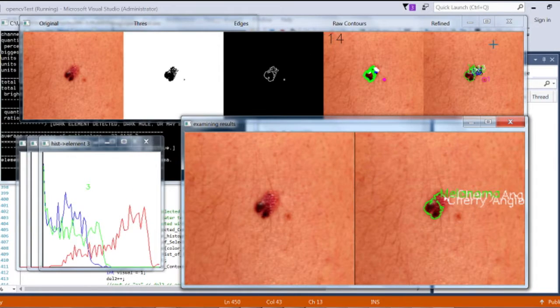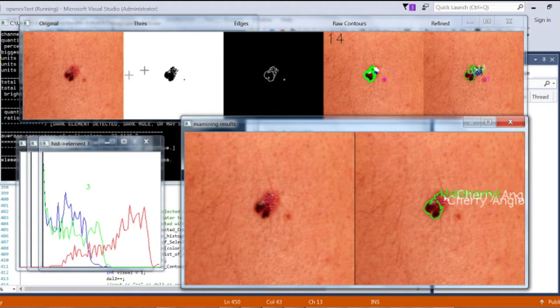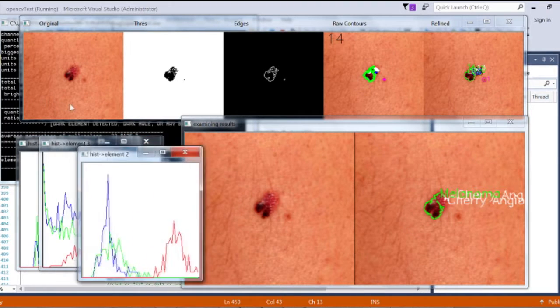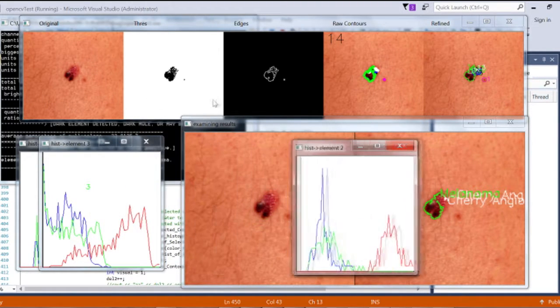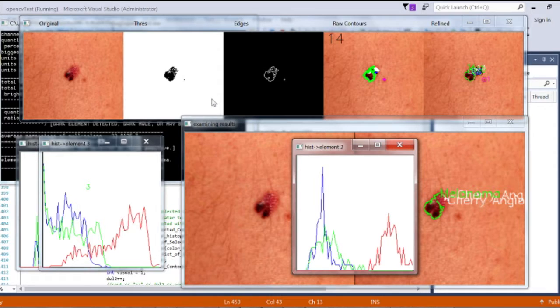The software has memorized the color profile for a few melanoma cases and, in this case, the darker colors, represented by the peaks on the left, allows for a successful identification of the disease.